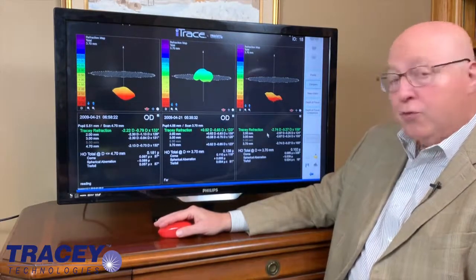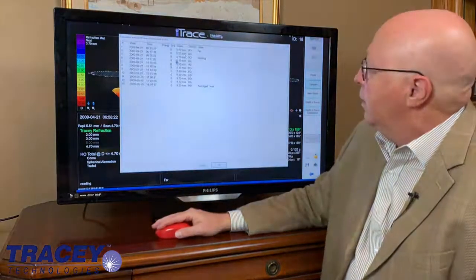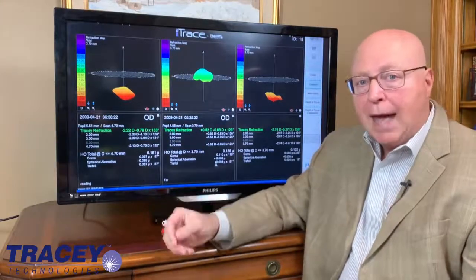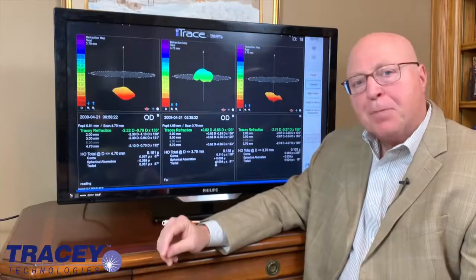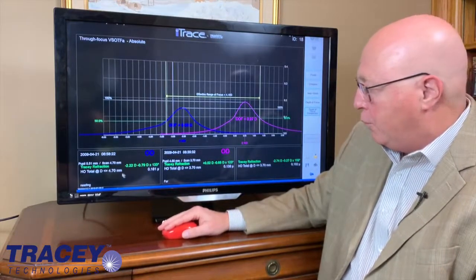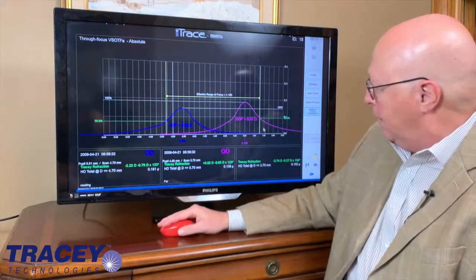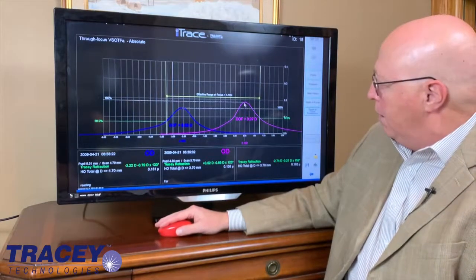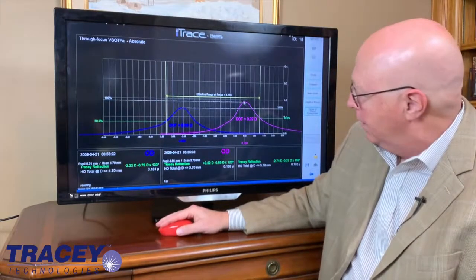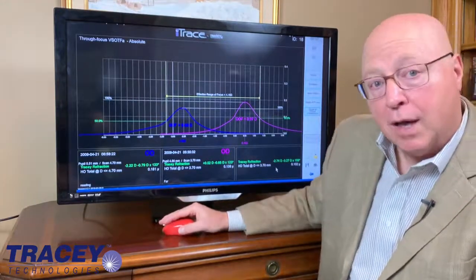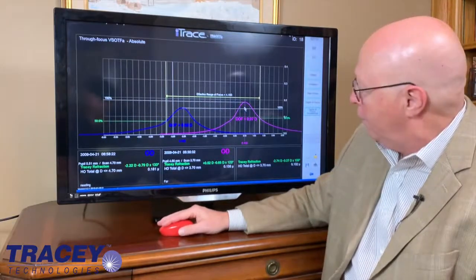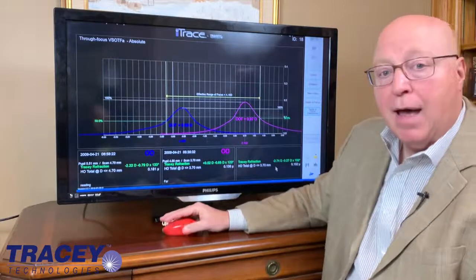This 2.75 is considered the true accommodation. When you look at depth of focus, you'll see a little bit why their true accommodation and their total range of focus don't match — it's something called pseudo accommodation. This blue curve is when the patient is reading; you can see they're at about a minus two and a half. The other curve is when they're looking at infinity and they're about a plus a quarter. The patient can get from this peak to this peak easily — that's 2.75, and that's called true accommodation. This overlap between the two peaks establishes their actual range of focus: the difference between four and a quarter and 2.75 is called pseudo accommodation.